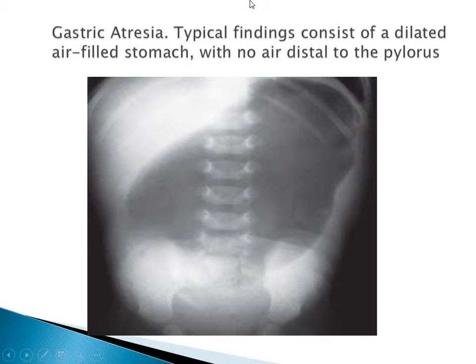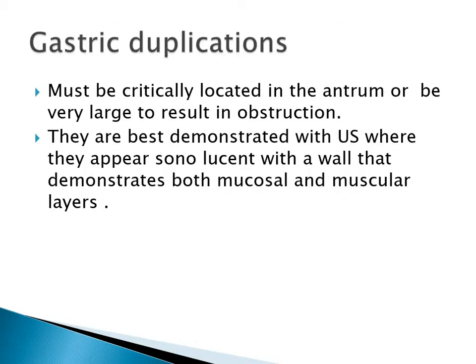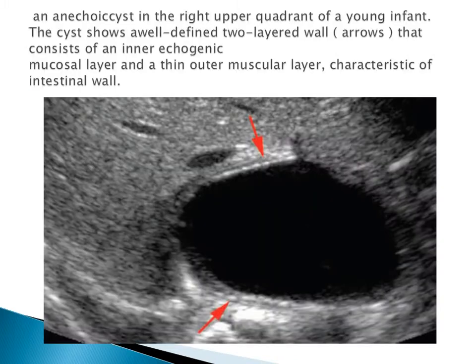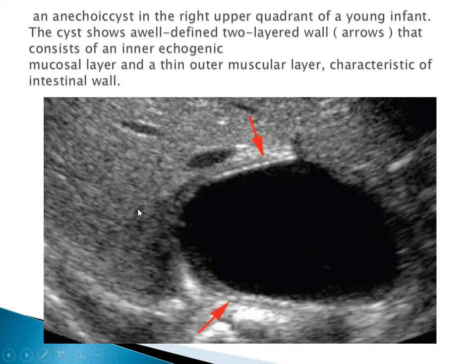This is a case of gastric atresia - findings consist of a dilated air-filled stomach with no air distal to the pylorus. Gastric duplication cysts must be critically located in the antrum or be very large to result in obstruction. They are best demonstrated with ultrasound, where they appear sonolucent with a wall that demonstrates both mucosal and muscular layers. This example of gastric duplication cysts shows a large cystic lesion in the upper quadrant with two layers visible.